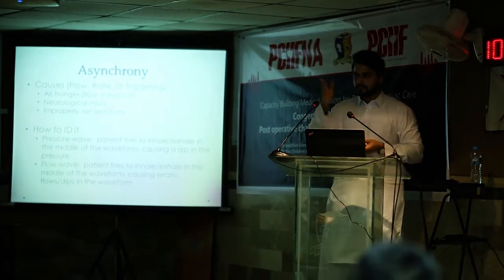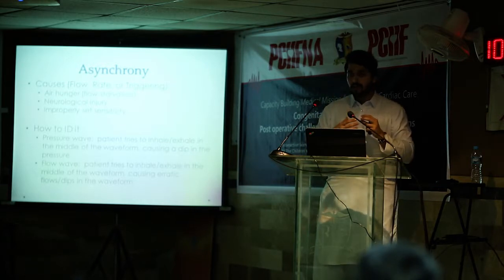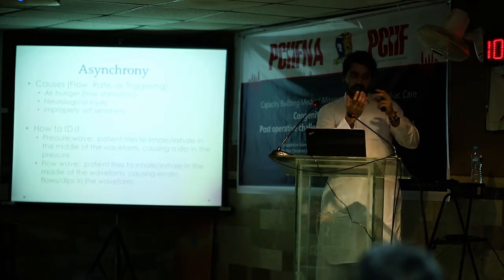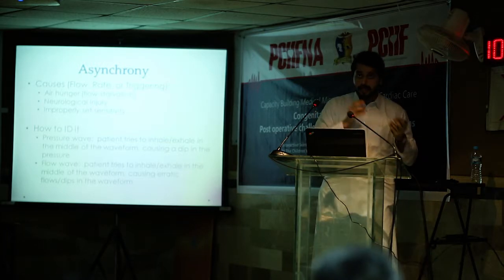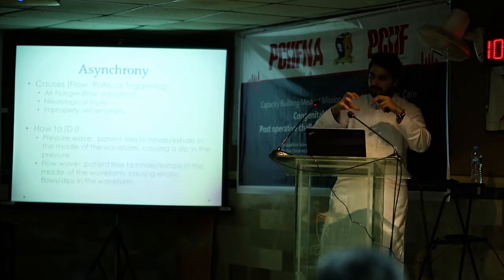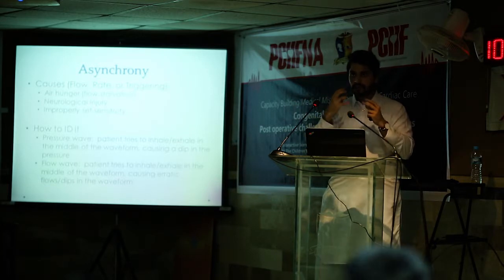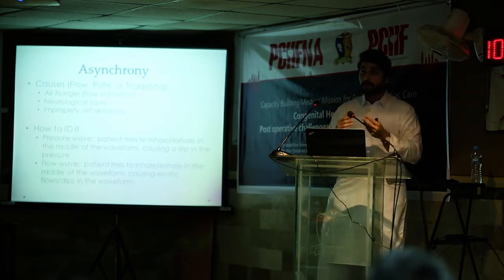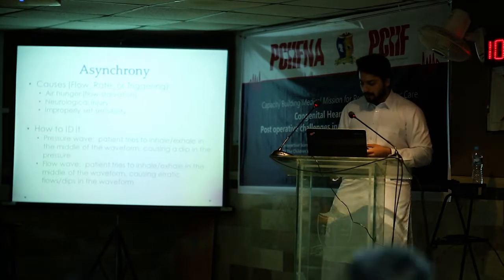Improper trigger sensitivity. The trigger sensitivity is very important. Imagine you set a sensitivity that is very difficult for the patient. In a mode like, as he explained, assist control, the patient can trigger and the machine can give a breath. But imagine you put a very difficult sensitivity. He wants a breath, but because it's difficult, the machine cannot detect it, so it's not giving. So the patient will become distressed: he wants the breath, but the machine is not giving. So there is asynchrony again. Setting a proper sensitivity is very important, and it will help give the best comfort to that patient. How do we identify that by the waveforms?